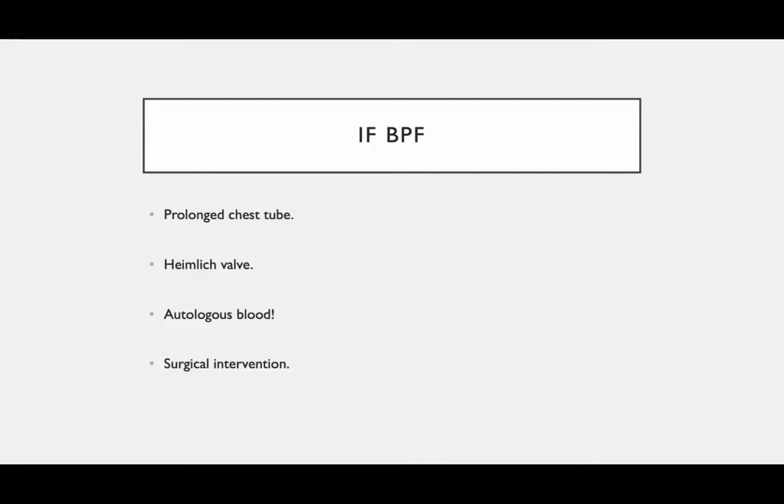You can use other methods like an intercostal muscle flap, okay, in case of coexistent empyema. You can do other options like a Clagett window, where you keep the intrathoracic space open to the atmosphere, and it will heal by itself with time. But it's very time consuming, and the patient will stay with you for a long time.